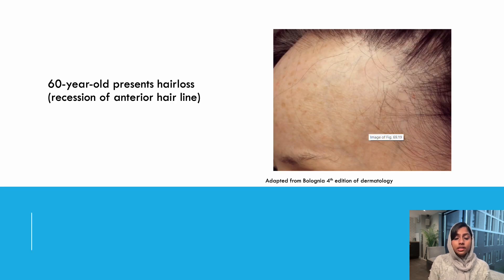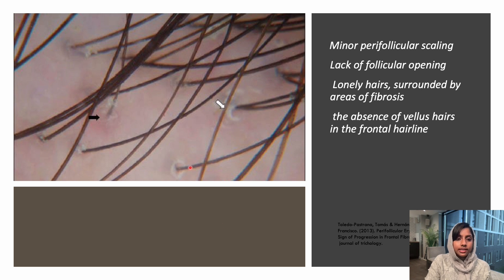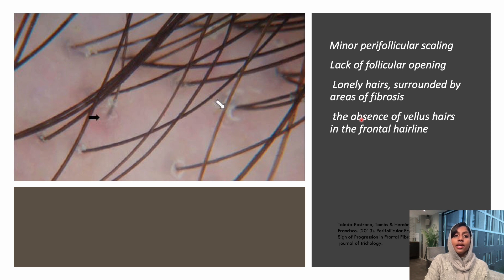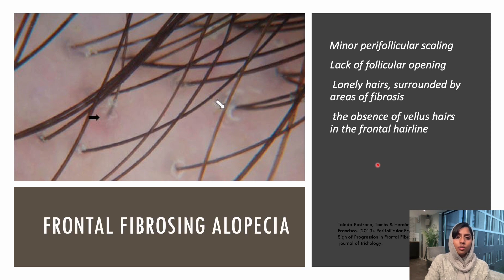The next scenario: a 60-year-old female comes with hair loss and recession of the frontal hairline. On trichoscopy, you can see perifollicular scaling which is very classical in almost all the follicles. Features include perifollicular scaling, lack of follicular openings seen as empty spaces, and lonely hairs — hairs surrounded by areas of fibrosis — as well as absence of vellus hairs in the frontal area. This is a specifically characteristic feature of frontal fibrosing alopecia.